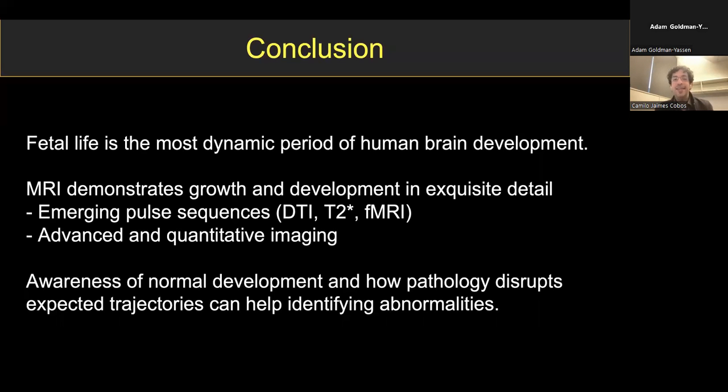So with that in mind, I like to wrap this session up by telling you that I find fetal imaging to be absolutely fascinating because it's the most dynamic period of brain development for a human being. I love MRI. I'm an MRI person. And I think MRI demonstrates the growth and development in exquisite detail. And if we combine information that we get from T2 weighted sequences, from diffusion, T2 star, and now people are starting to do fMRI and other really, really cool things, I really think this is a truly hot and fascinating area for research.